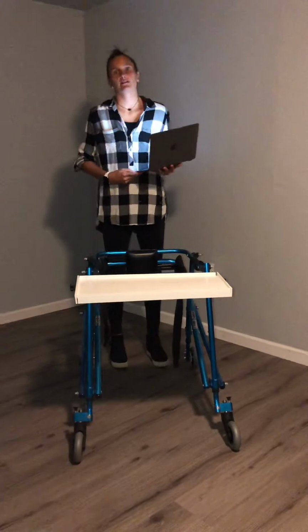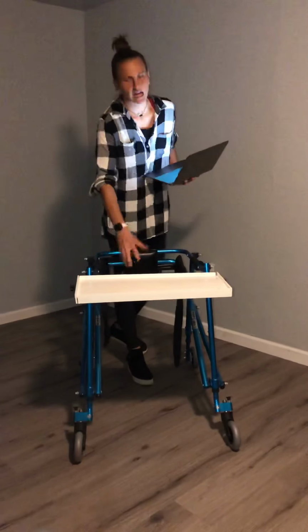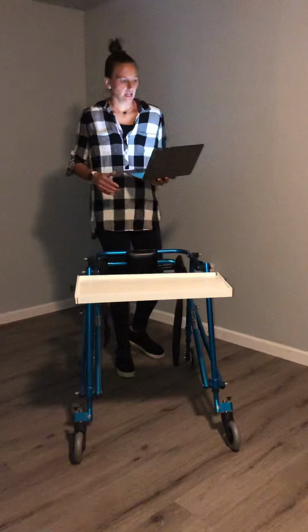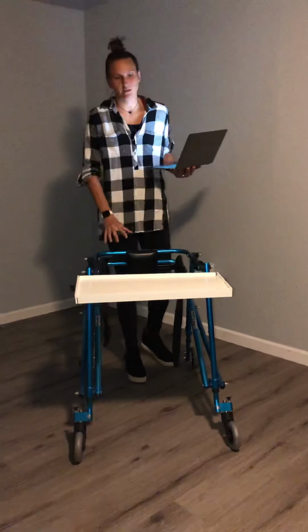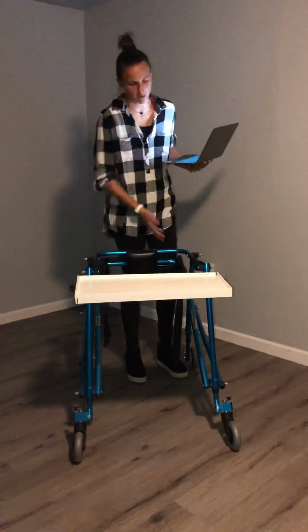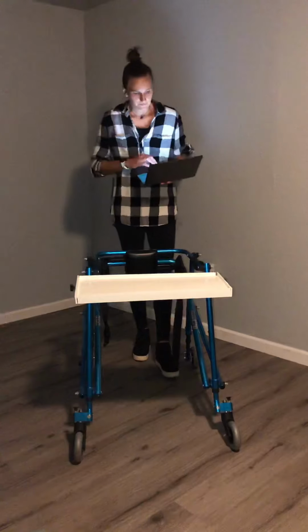I'm going to talk to you guys about my expo project. So I named my expo project the dual purpose tray or the dual purpose desk, and I'll explain why I named that here in a second. The main purpose of my project was to create independence for someone that is going to be using a Nimbo Posterior Walker, which is this blue walker right here, designed to keep someone in an upright position. It's also known as a gait trainer.